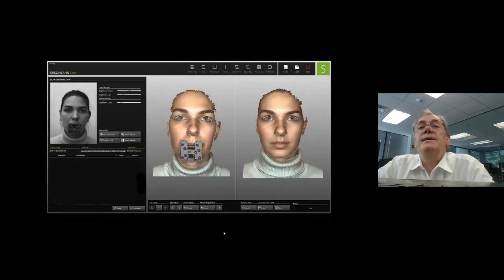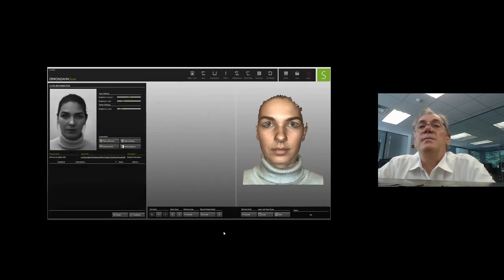And again, a picture is taken by means of the Face Hunter in order to capture those markers, which will be necessary during the matching process to align the model directly into the patient's face.